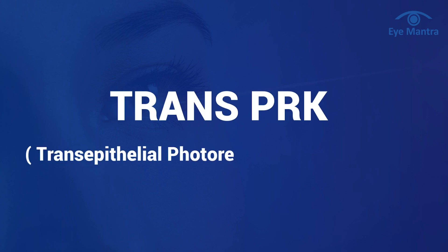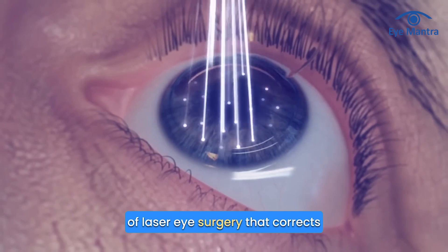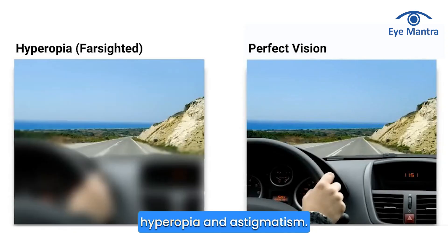Trans-PRK, transepithelial photorefractive keratectomy, is a type of laser eye surgery that corrects vision issues like myopia, hyperopia, and astigmatism.